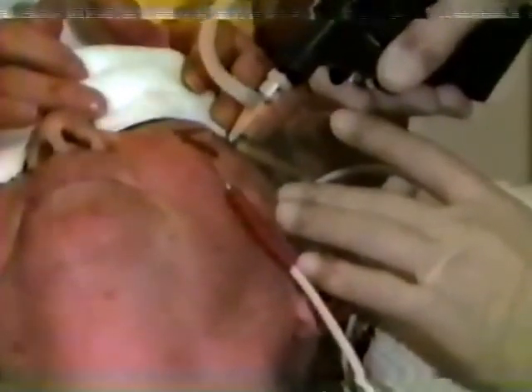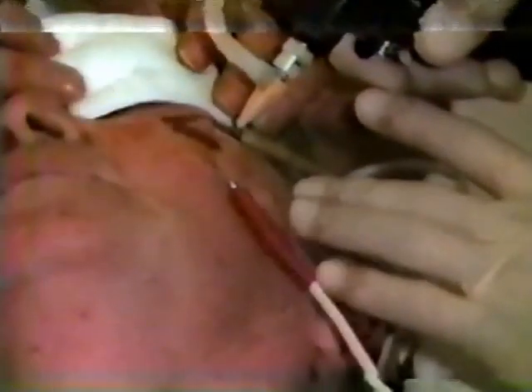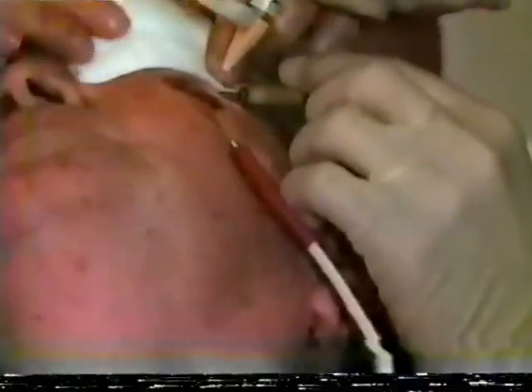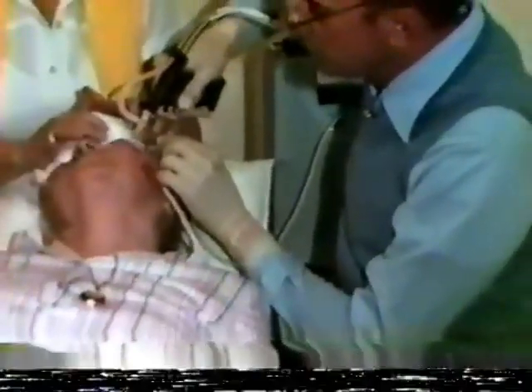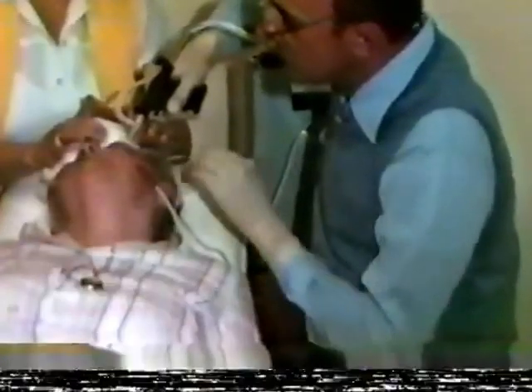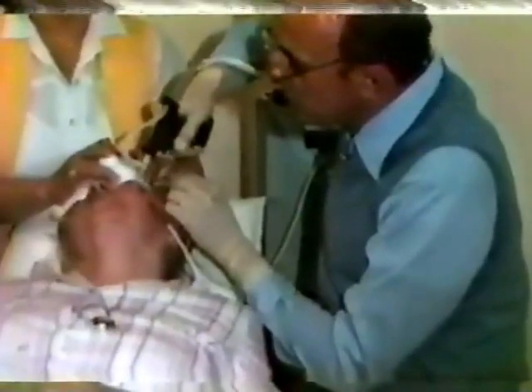Is that cold, Esther? Yes. How uncomfortable is it? Not bad. No. It's very cold. As you can see, I'm leaving a rim of normal tissue around the skin cancer itself. Keep your hands down, Esther, okay? Yes, push down on the eye. Is that better? Yeah. Atta girl.